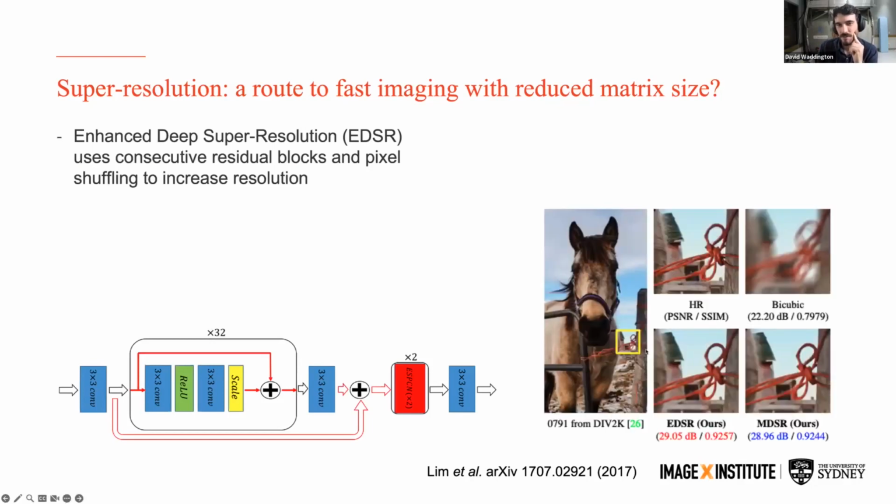To give you an image here from the original paper, you can look at what standard interpolation techniques give, the blurry bicubic upsampling you might get, this EDSR, and a ground truth image in the middle. This shows the performance difference between bicubic interpolation and what AI enables. A huge improvement that's very obvious just to the naked eye in upsampling images.